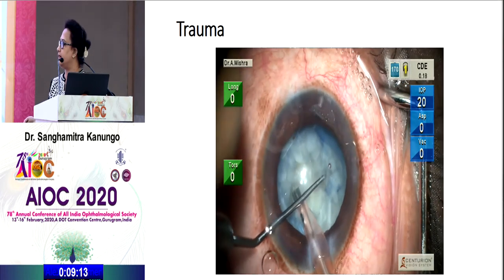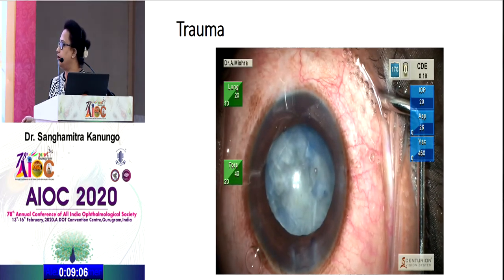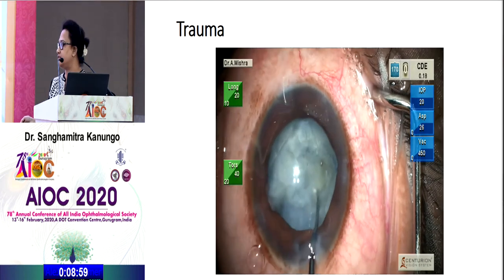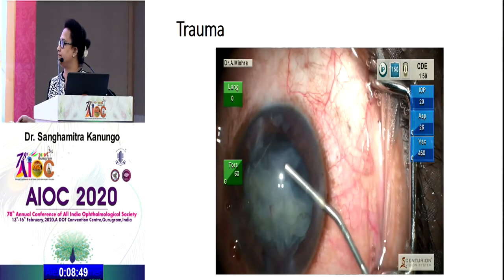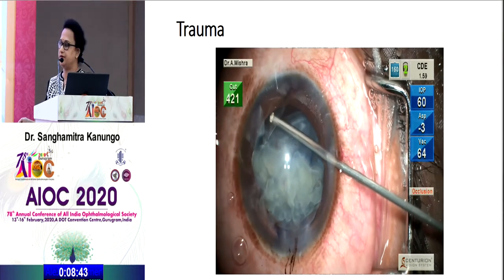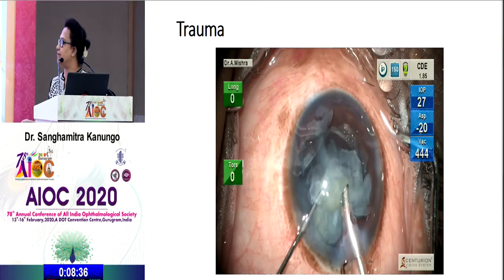The surgeon tries to rotate it again and complete the phaco, but the nucleus does not rotate easily. The nucleus goes down and there is a dialysis found. Some anterior vitrectomy is done, but the dialysis moves further with some drop. The surgeon abandons phaco, extends the wound margin, does a SICS, and sends it for SFIOL.